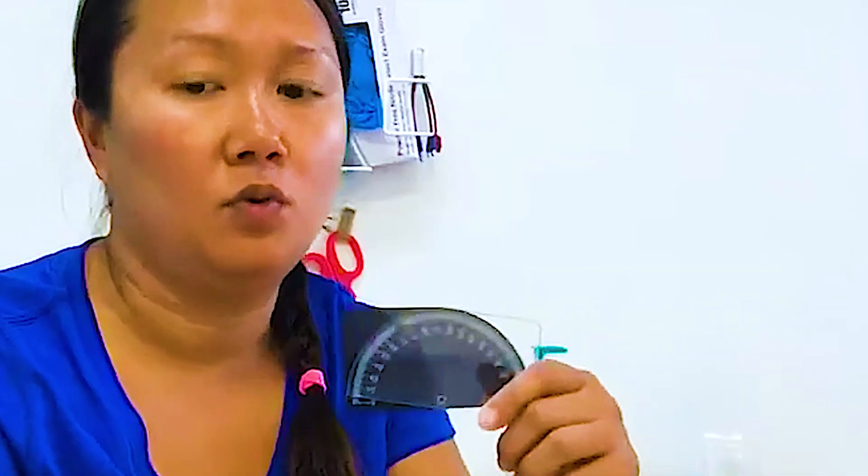I like to use a half-moon goniometer. We have two of them for the hand, the wrist, and the forearm. This is what I normally use. I have a smaller one here. This can be for the thumb CMC, or radial and ulnar deviation, CMC abduction, adduction.